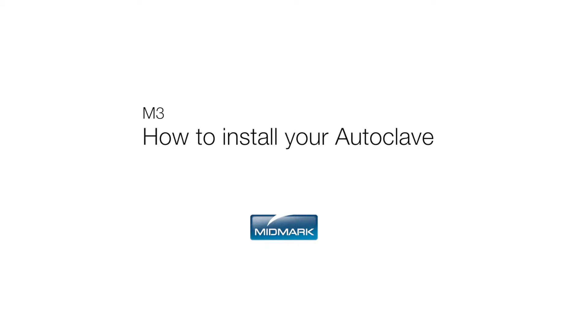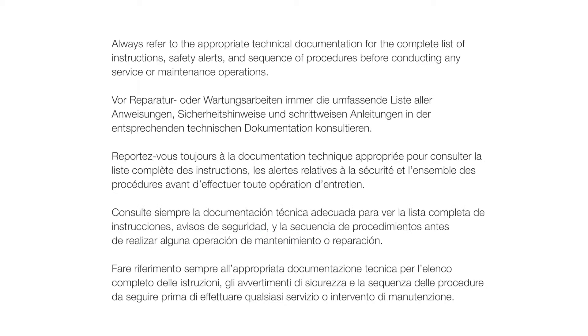This video is an overview of how to install your M3 Ultrafast. Always refer to the appropriate technical documentation for the complete list of instructions, safety alerts, and sequence of procedures before conducting any service or maintenance operations.